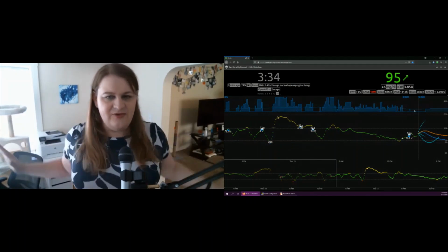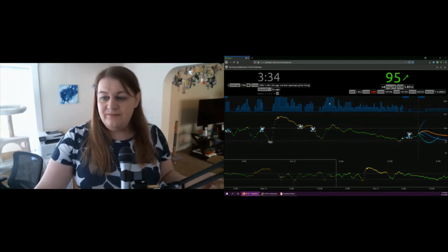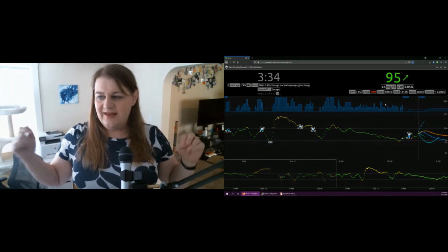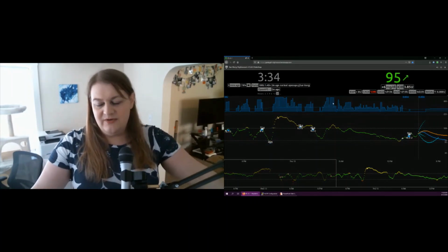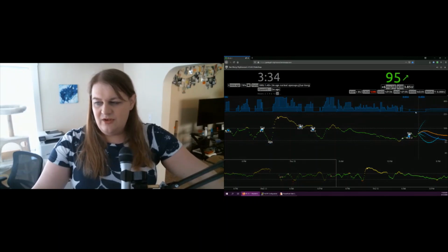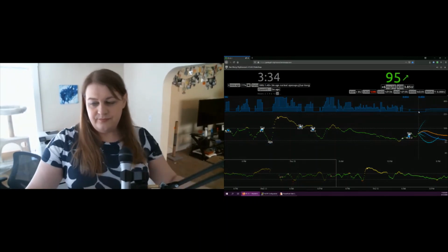So if none of this was working, that's how much insulin I would be given. But the actual graph, is it adjusting every 5 minutes? Like, hey, you need a lot more over here to counteract this, but over here, you might have too much in you. We're going to cut you off to make sure things are fine.